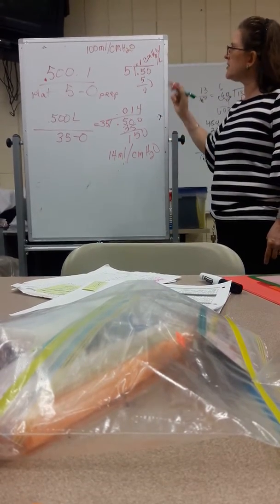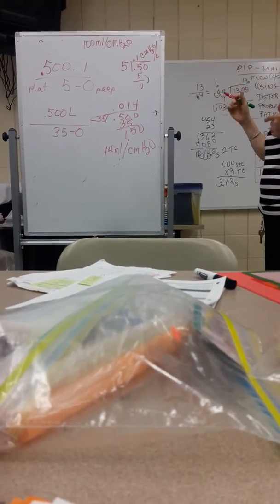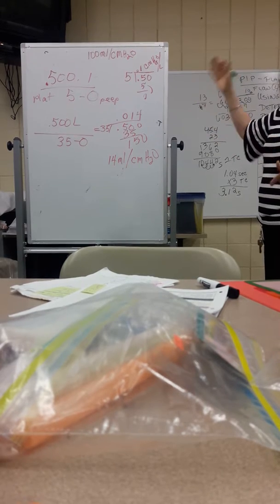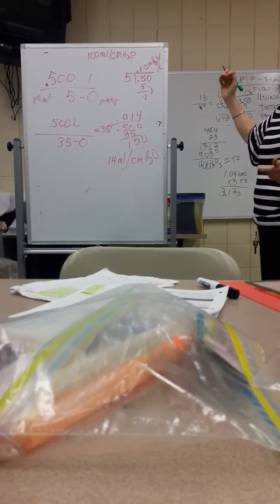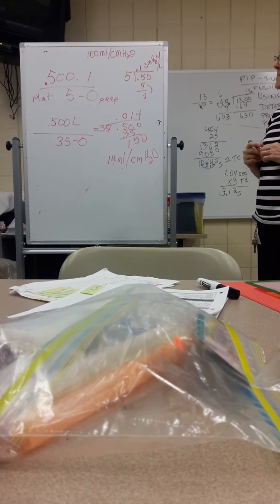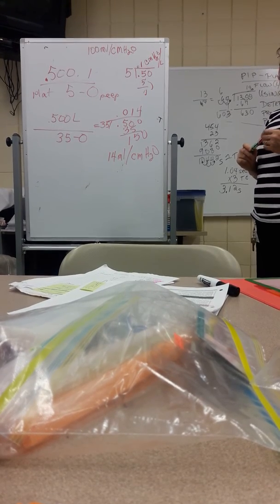If I gave you a problem where your tidal volumes are the same, or the pressure you're using on pressure control ventilation is the same, and PEEP is the same, but your plateau has now increased from 10 to 20, what's happening to your compliance? You can quickly do the math there.